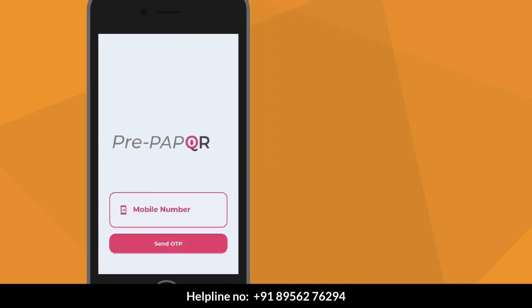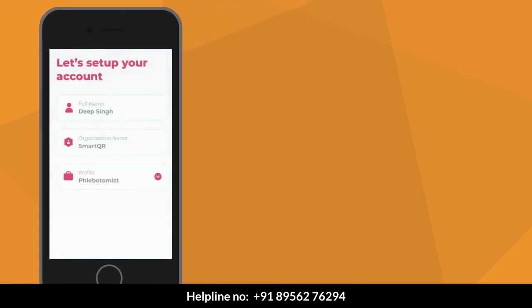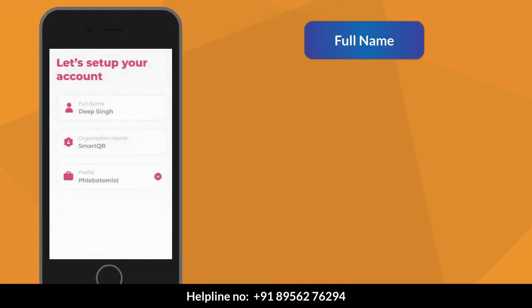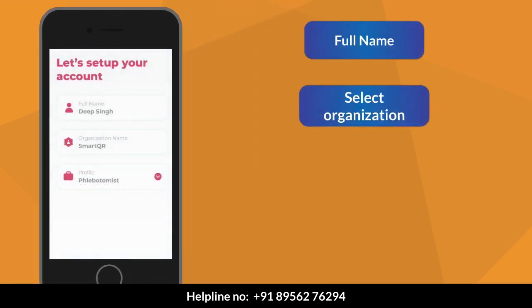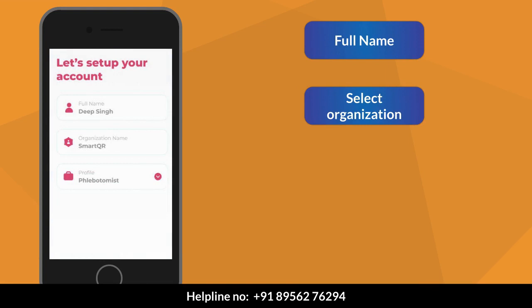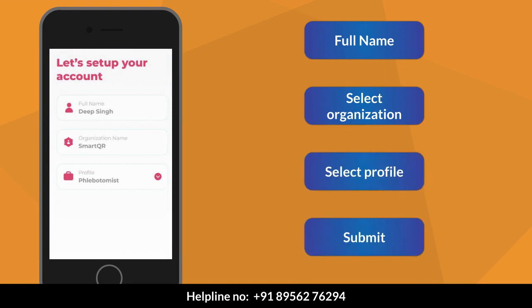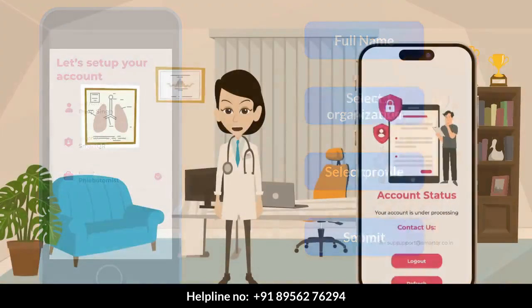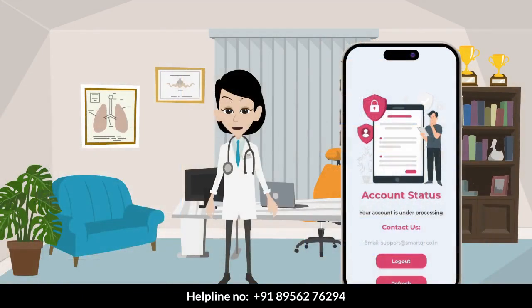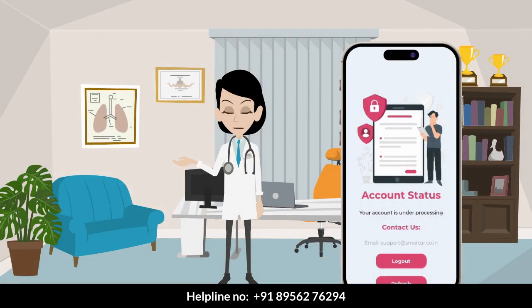You will receive an OTP in a message — verify your OTP. Set up your account by filling in your full name, select your organization, select your profile, and submit. We will provide you access within a few hours, after which you can use the application.